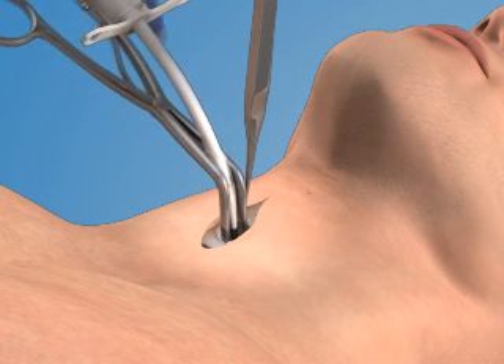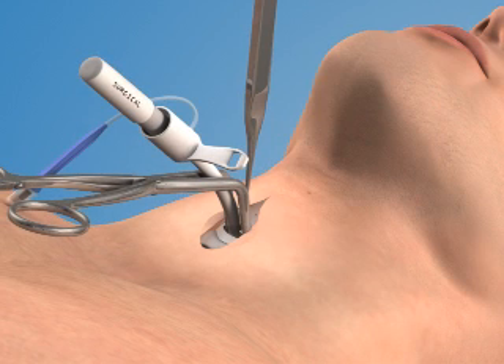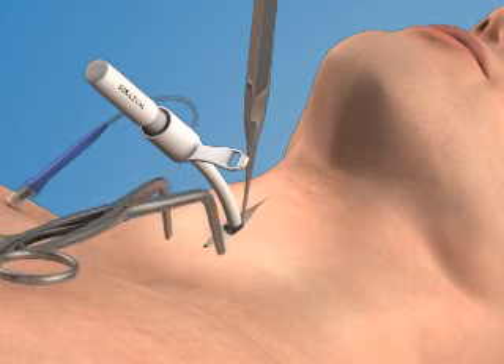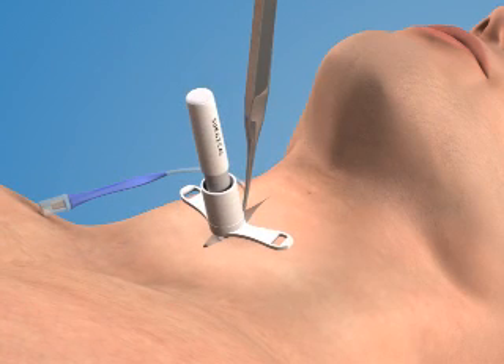Then rotate the dilator and the airway together 90 degrees while advancing the tube further into the trachea. Advance the airway catheter completely so that the flange of the device rests against the patient's neck.